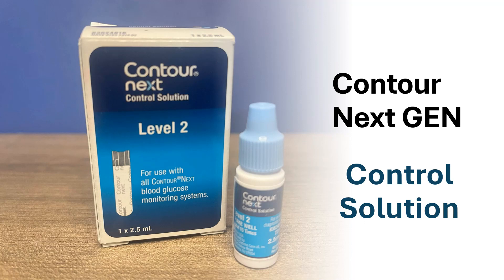Hi, this is Josh, pharmacist with Learn Blood Sugar Testing. I'm going to go over what is a control solution and how to use the control solution for the Contour Next Gen blood glucose meter.